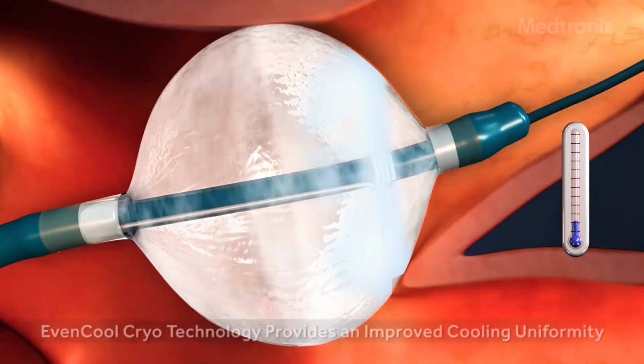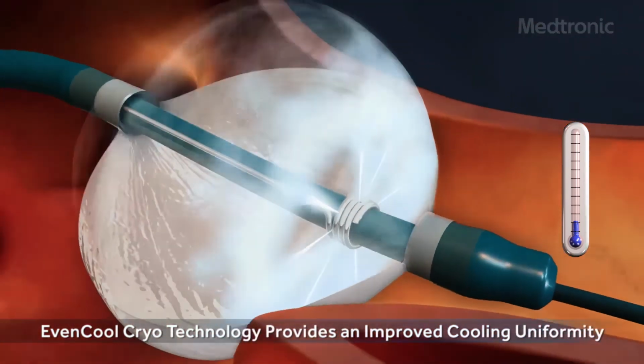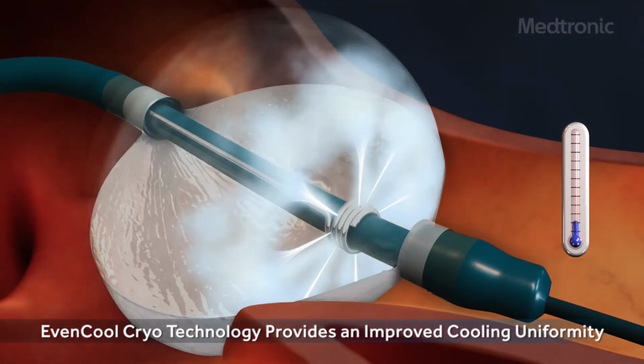The main difference and the main reason why I and a lot of doctors like using cryo is because when you're using a balloon and you're in the proper place, you're delivering all that energy around the entire circumference of the balloon. When you're using the heat energy, we're using a point catheter where only the tip gets heated up, and we have to move that catheter around the circumference of the vein to achieve a circular line of scar to get that block we're looking for.